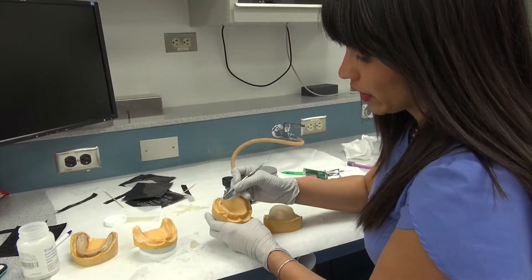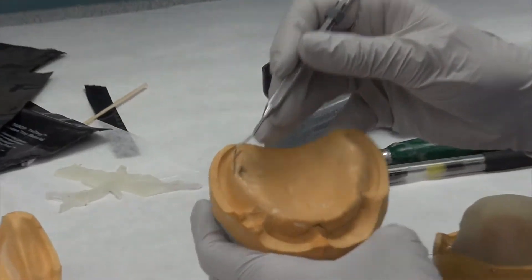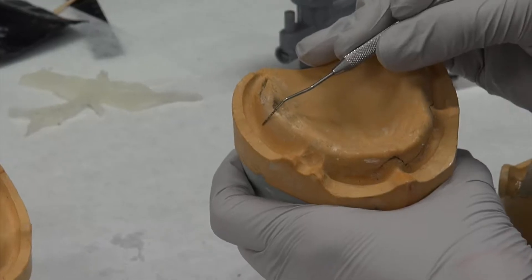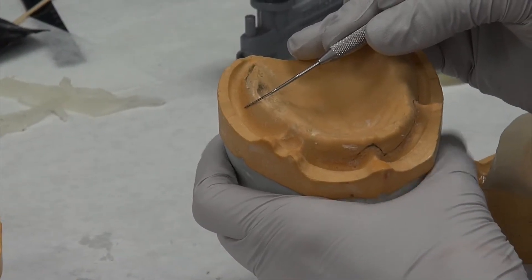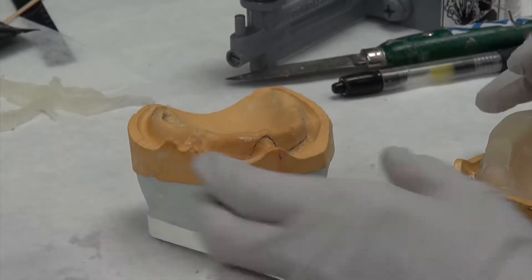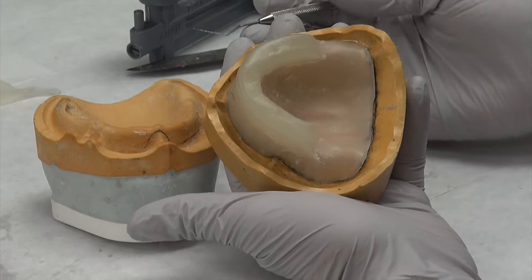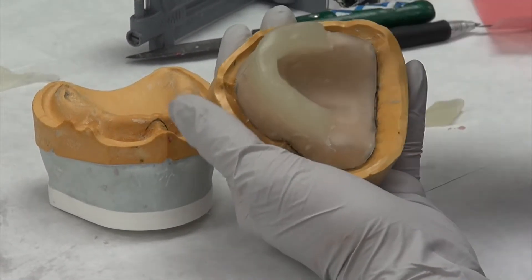Some key features: you want to mark on your cast or be able to understand where the ascending portion of your maxillary tuberosity is. Now that's going to be your limit for your posterior teeth.